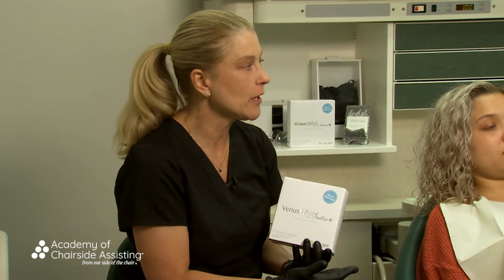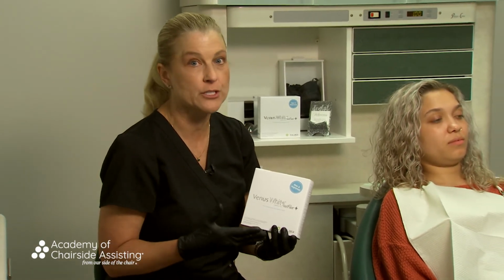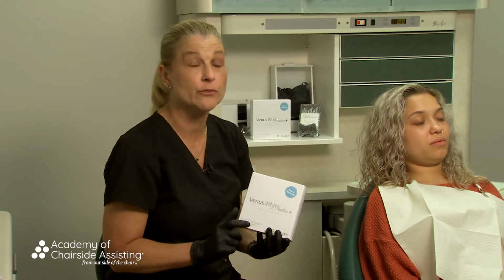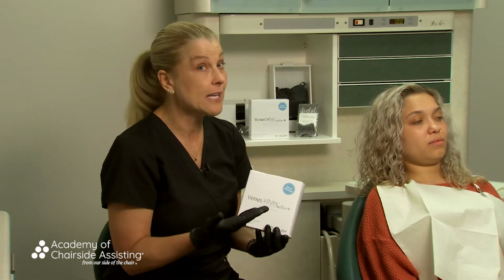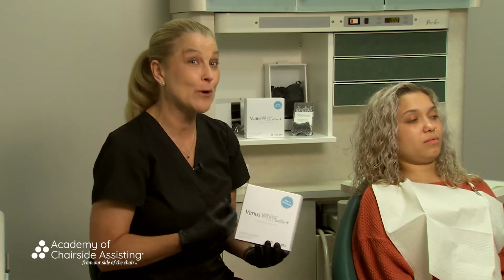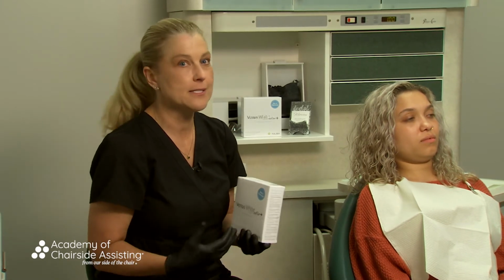Documenting the shade, showing patients the shade, taking the photos, that is so realistic. And then when we see her again in 7 days, I'm going to reshoot those same photos that I took. I'm going to take that full face. I'm going to take the smile. I'm going to take the retracted views. And again, taking that shade tab to show her this is where you started and this is where we are today. And we're going to celebrate together with that amazing shade change.